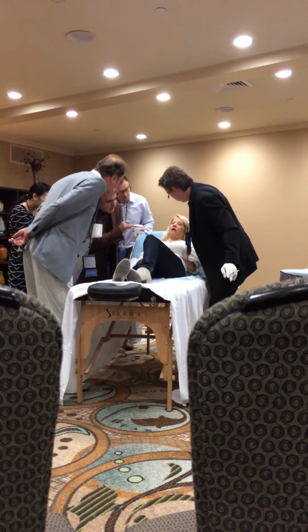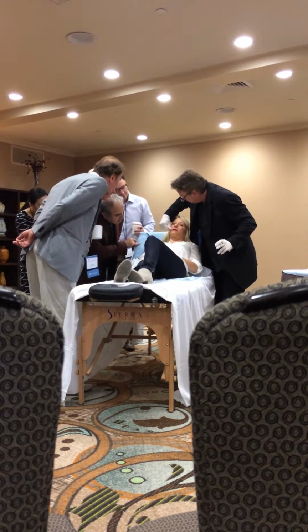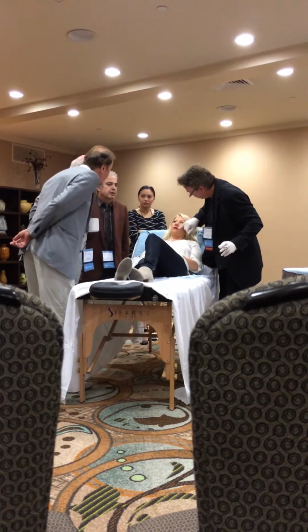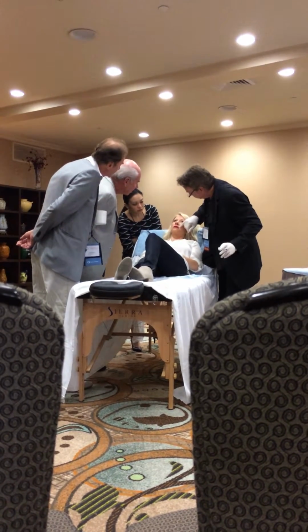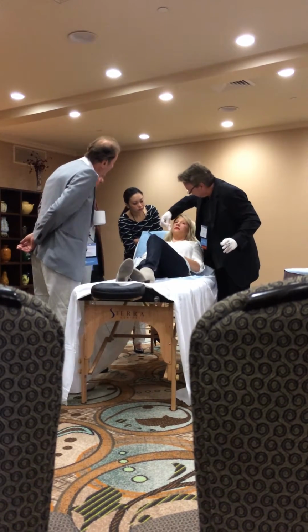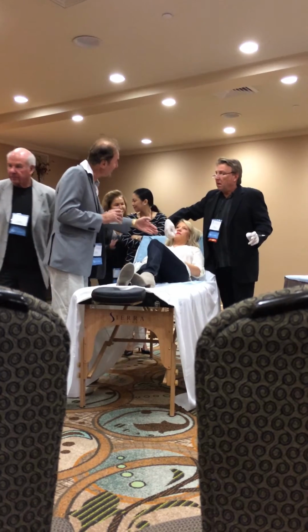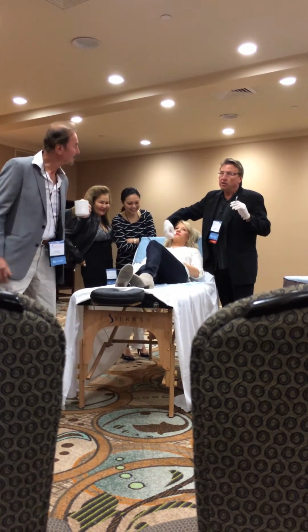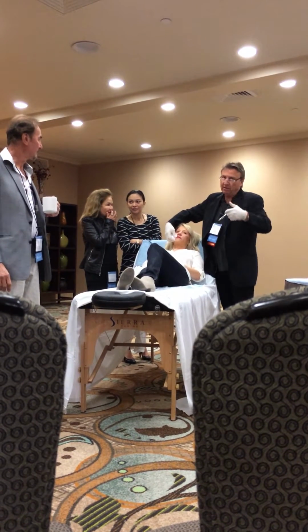Okay? See how it popped up a little, like I injected? She has lipstick, I went in the skin, down right here, and just popped it right there. And what it did is went from this to this, for those that want that, okay? I did it on her because she's got some lipstick on, but you can go from the lip side. Actually, I prefer to go from the white lip down into the red lip.